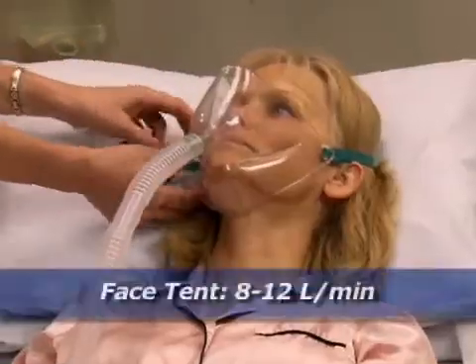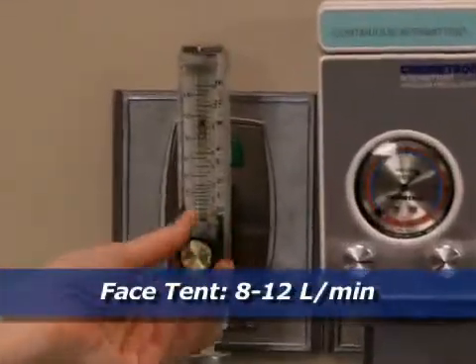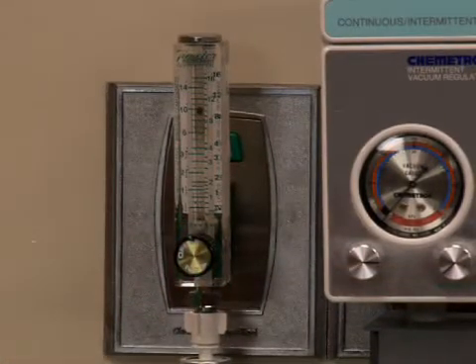If your patient has a face tent, set the flow rate at 8 to 12 liters per minute, as prescribed, which delivers a highly variable FiO2 of 28 to 100%.